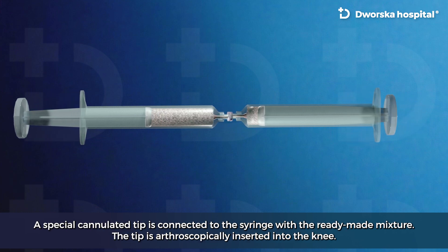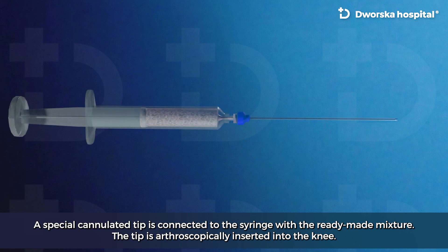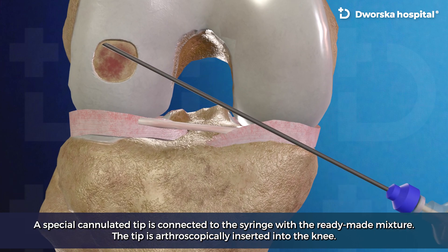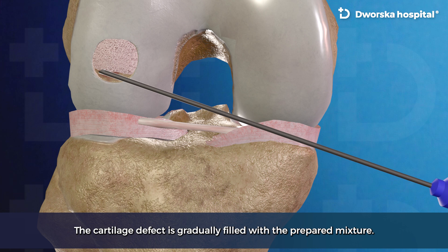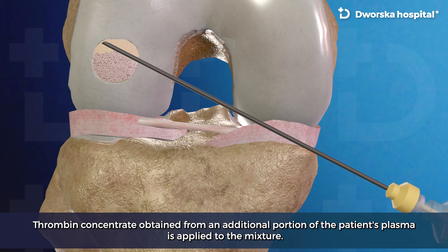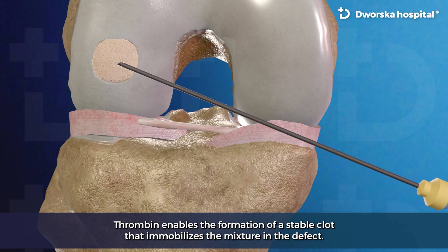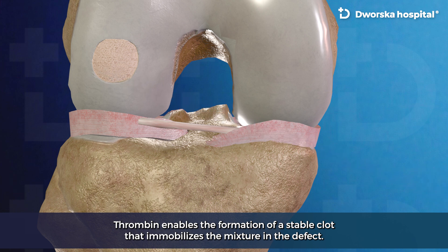A special cannulated tip is connected to the syringe with the ready-made mixture. The tip is arthroscopically inserted into the knee. The cartilage defect is gradually filled with the prepared mixture. Thrombin concentrate, obtained from an additional portion of the patient's plasma, is applied to the mixture. Thrombin enables the formation of a stable clot that immobilizes the mixture in the defect.